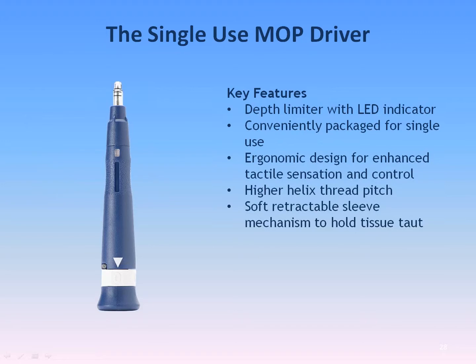How do we create those areas of inflammation? Well, again, in the previous lecture, you can look at all the different techniques of corticotomy. We're going to, though, focus on 3 different types of Propel devices that are available.